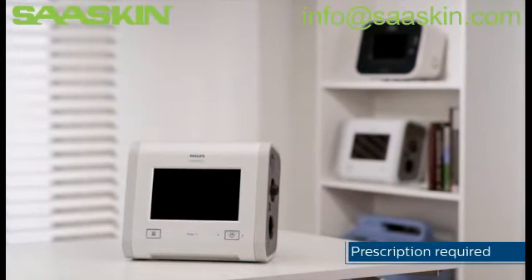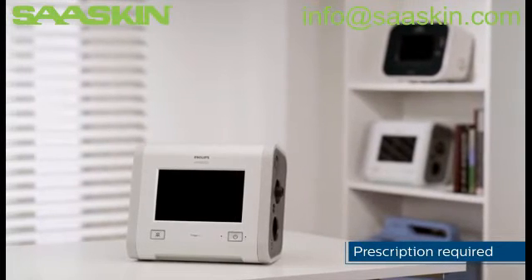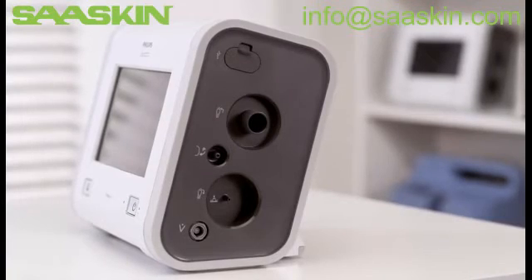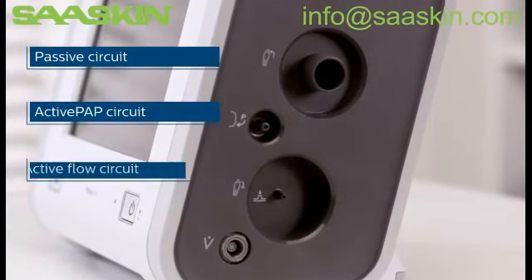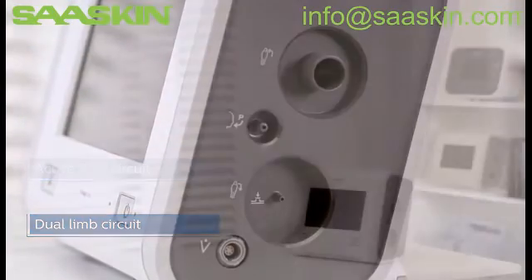Trilogy EVO ventilators deliver enhanced performance in both non-invasive and invasive ventilation. There are four types of circuits that are available: passive, ActivePAP, active flow, and dual limb, with corresponding icons. We are going to review the setup of each one.